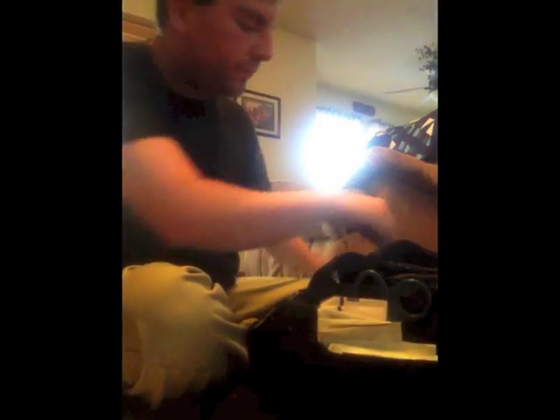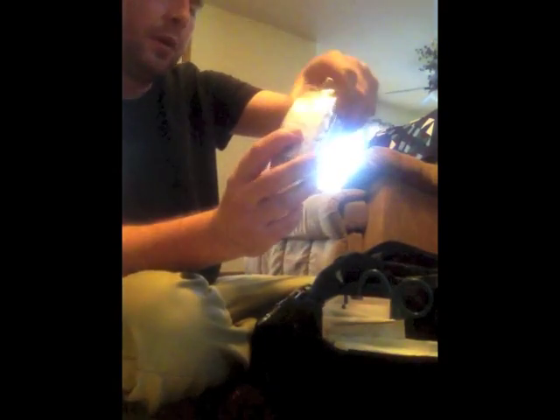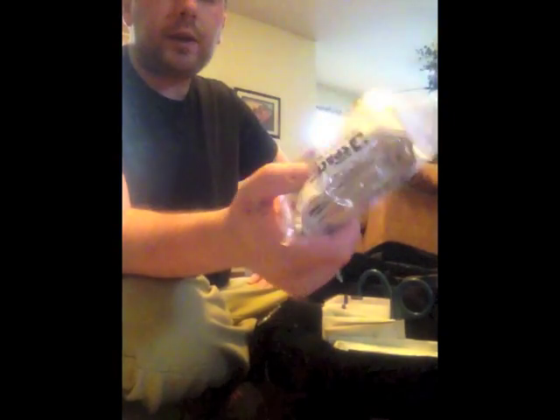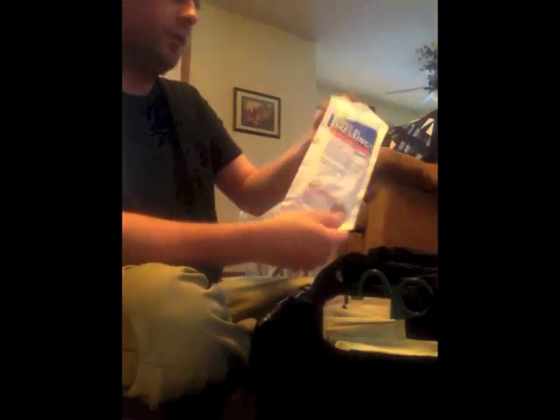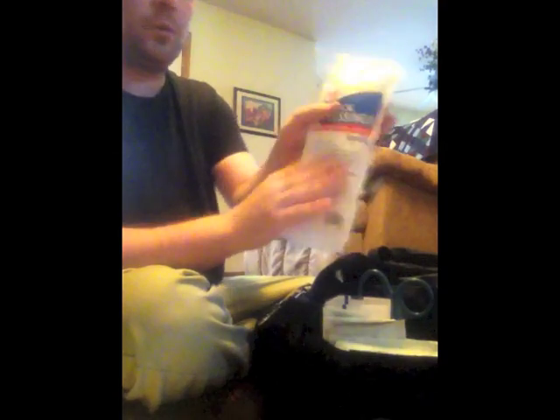Also in here, we have a little trauma pad. Then I think I have one or two of these. This is an emergency blanket. You can buy these at Big 5, Sports Authority, whatever. But these are just good to have, especially if somebody's going into shock and you need to warm them up. Then we have a whole bunch of surgical dressings. These are another 8x10s, just more elongated.